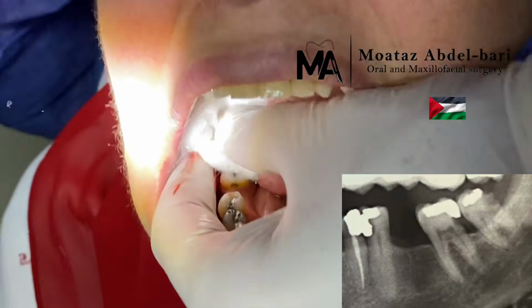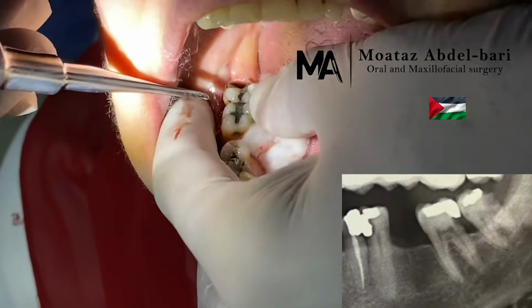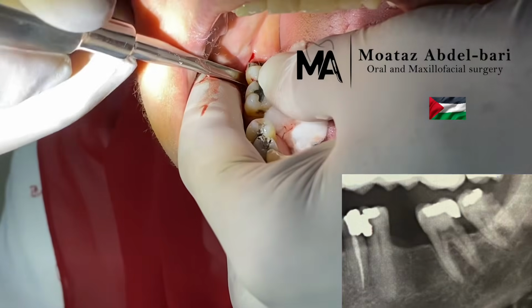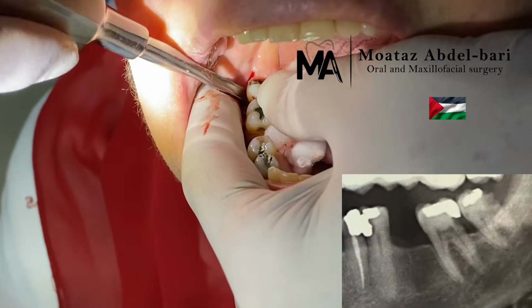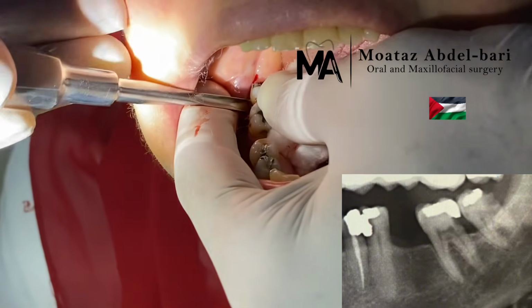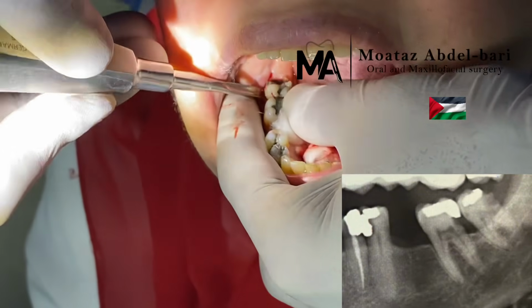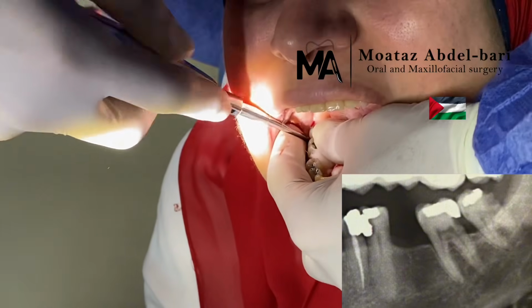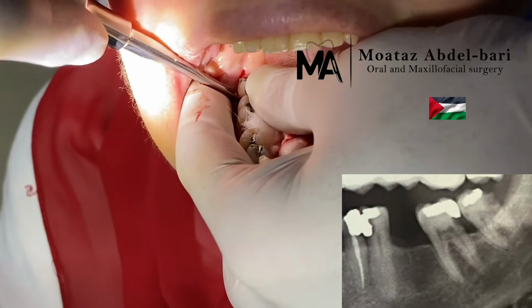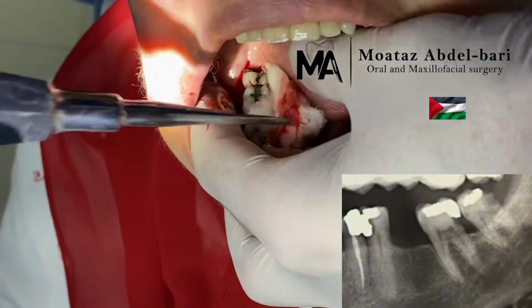Searching for any method for luxation of this tooth, due to its inaccessibility by forceps, as well as difficulty in luxation by elevator. But I feel some progression like this, but it's unusual. This is called interpretation of the finding and interaction with it. I place my thumb of non-dominant hand on the occlusal surface to assess the luxation. Is it luxated or not? From the buccal side, I decide to assess whether it is luxated or not. Maybe this is a buccal curvature of the root that will not appear in the radiograph.